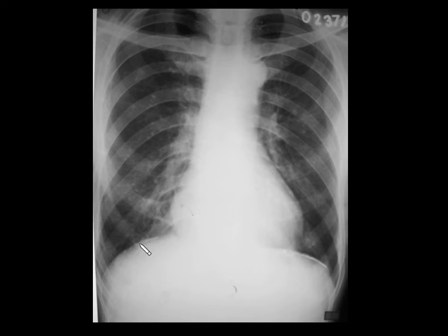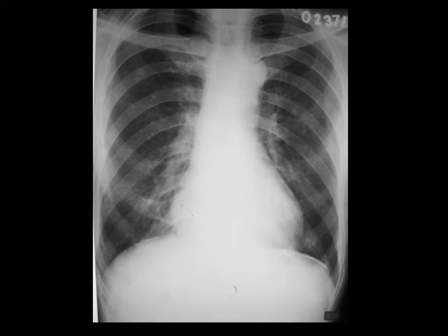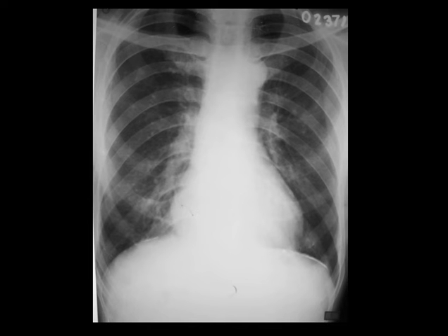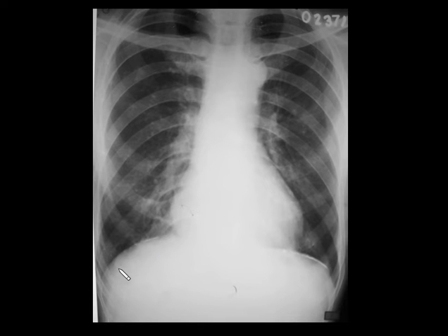Coming to the next spotter, you can see bilateral pleural calcifications. These are calcified pleural plaques from asbestos exposure, typically with sparing of the costophrenic angles. Other causes include hemothorax, infections like pyothorax and empyema, tubercular pleuritis, previous surgeries, and radiation therapy. Symmetrical bilateral pleural calcifications with sparing of the costophrenic angles — remember asbestosis.